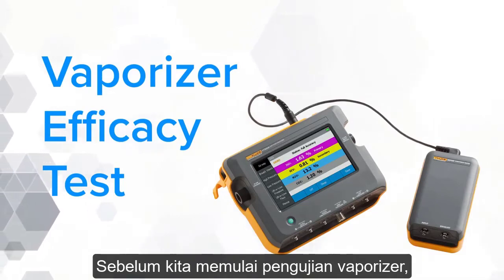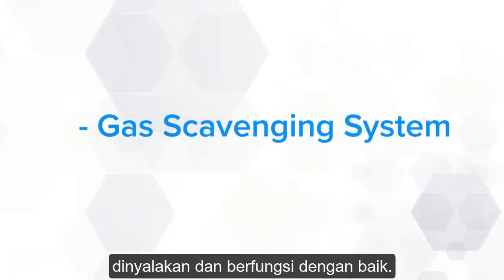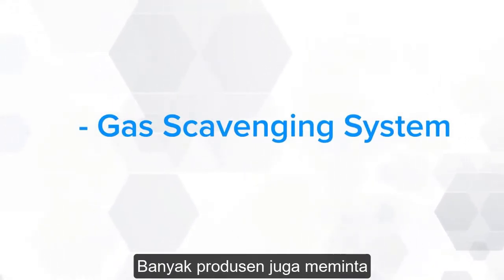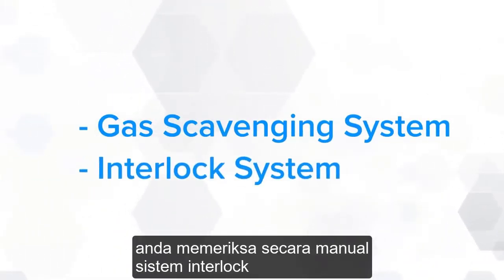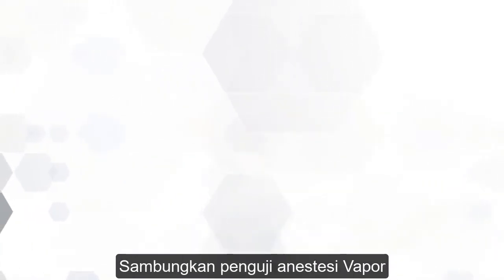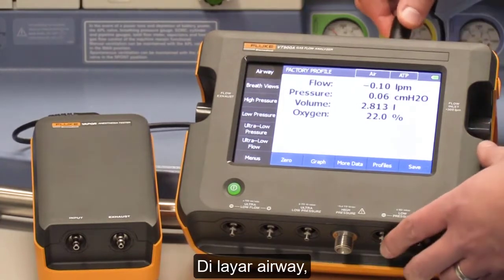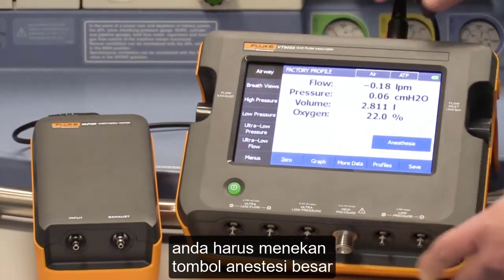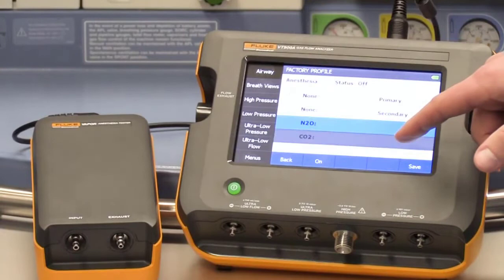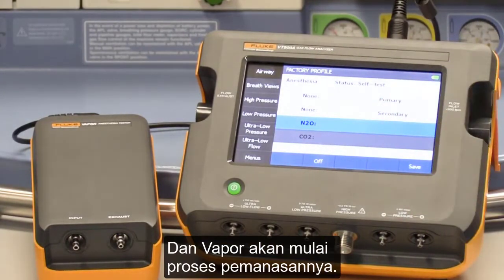Before we start vaporizer testing, we should ensure that the gas scavenging system is turned on and functioning properly. Also, many manufacturers ask that you manually inspect the interlock system so that only one vaporizer can be in operation at one time. Plug the vapor anesthesia tester into the VT900A via the connection in the rear. On the airway screen, you should press the large anesthesia button to access vapor. Here, you press on and the vapor will start its warm-up process.